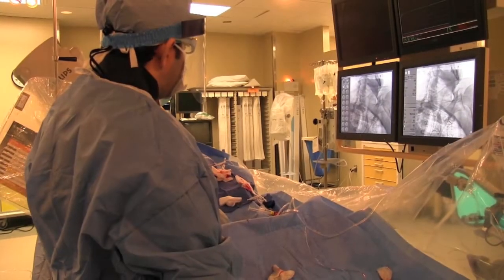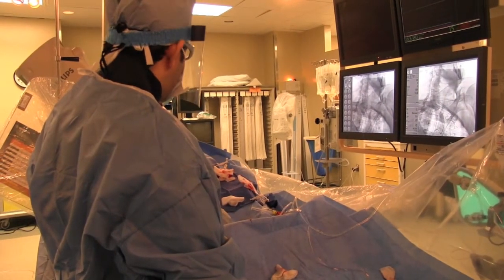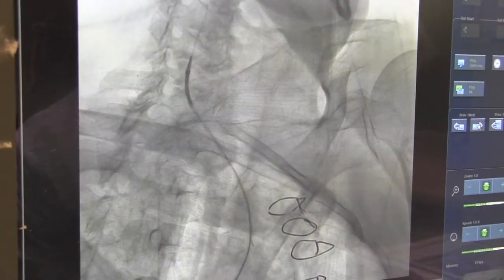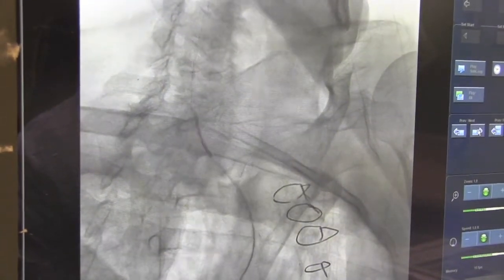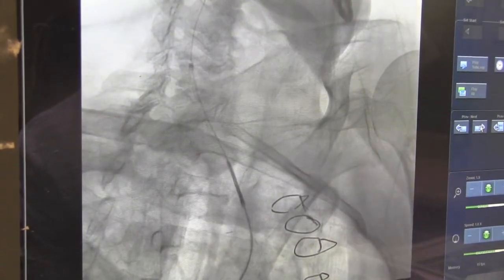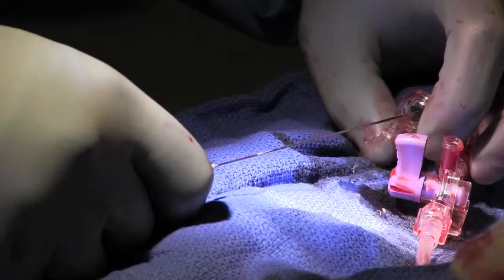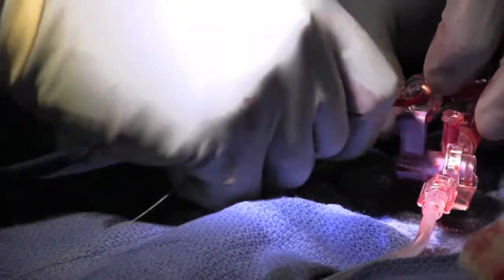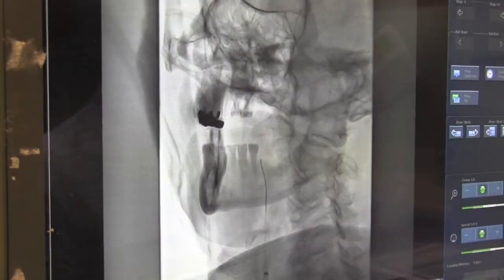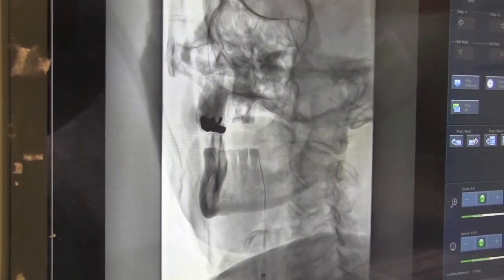Here we've advanced our shuttle system over our JB2 catheter into the right common carotid artery. Once we do that, we can remove our JB2 catheter and slip catheter. Here we're carefully advancing a guidewire through the narrowing in the carotid artery.